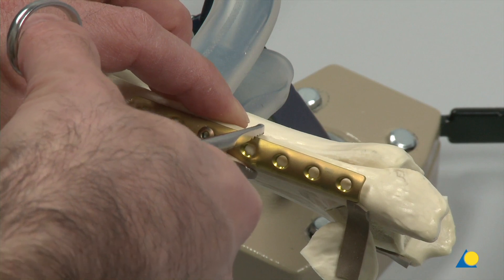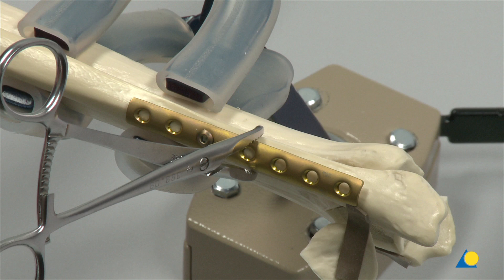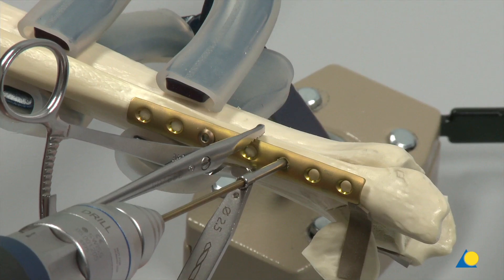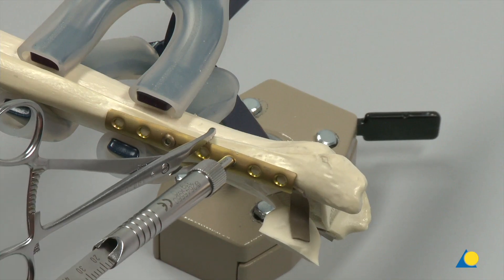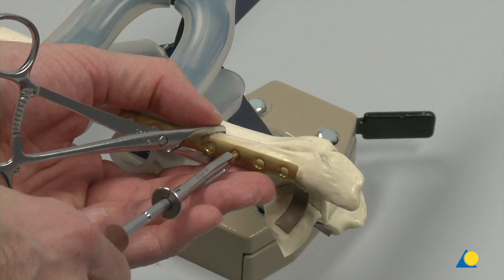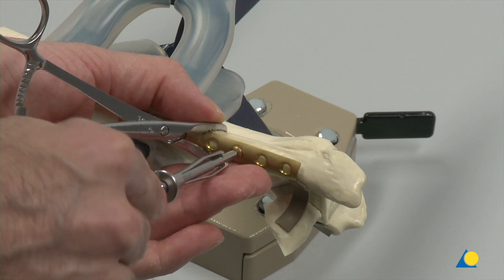A final fracture reduction is performed over the plate using the toothed reduction forceps. Pointed reduction forceps can also be used from a medial-lateral direction, however, this requires more soft tissue dissection. The 2.5 mm drill bit is used to drill eccentrically through the 3rd distal plate hole. The depth gauge is used to measure the required screw length. The 3.5 mm self-tapping screw is inserted into the drilled hole resulting in axial compression. As the eccentrically placed compression screws are tightened, the head moves down the ramp in the plate hole and compresses the bone together.